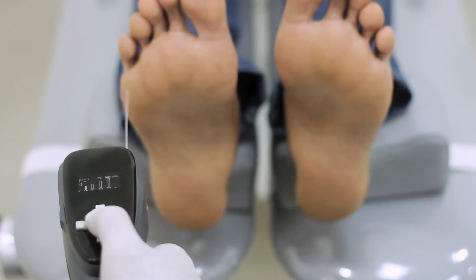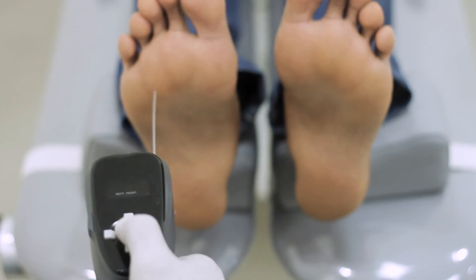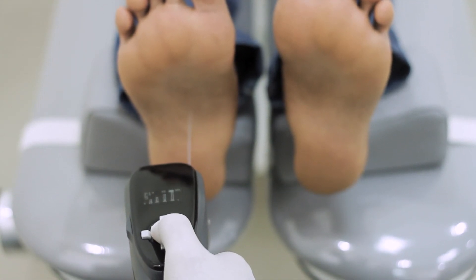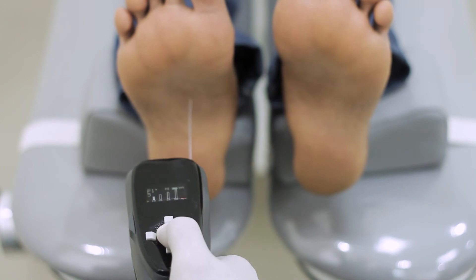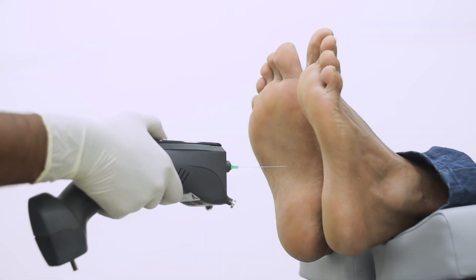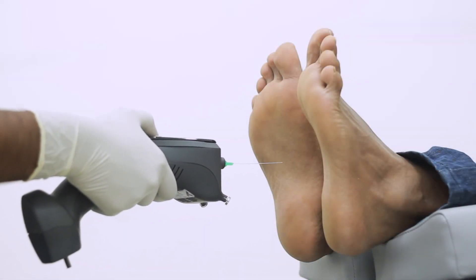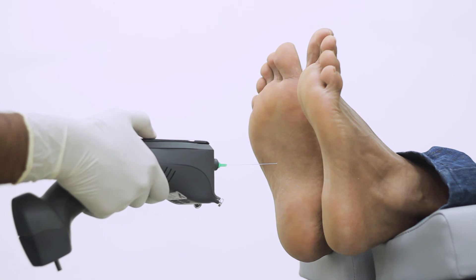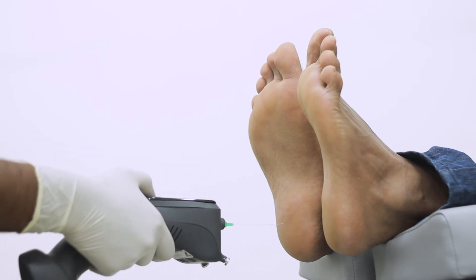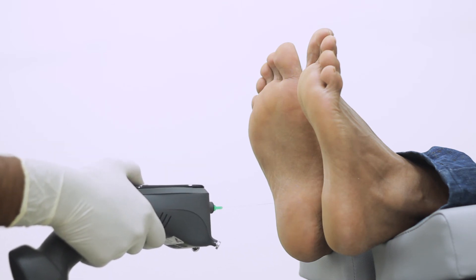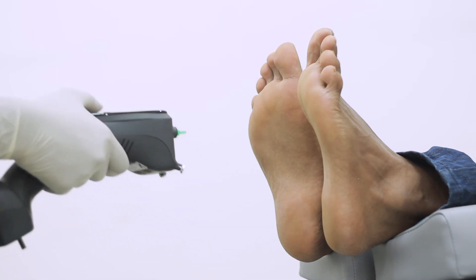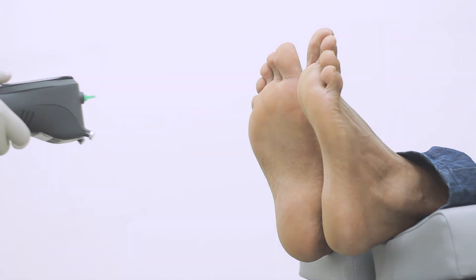Press the center key to display the exact value of the force applied in grams. Press right key to save the value of the result at current point. Test will move on to the next point after saving the previous data.